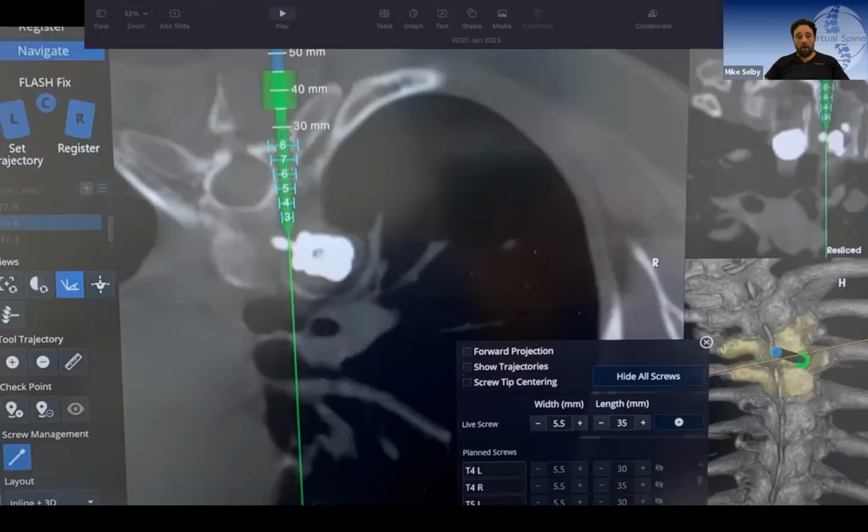We just took a pic because I was redoing a broken tether in the thoracic spine, done elsewhere, but I've got my own. And just using this technology where there are anterior screws already in the thoracic spine to plan our screws posteriorly. So this would be a super challenging case to do freehand, because with your pedicle probe, not only are you trying to get down a tight pedicle, but you're running into implants halfway down the vertebral body. So we managed to instrument all pedicles from T3 to T12 with the exception of 2, using this technology. I had a lot of sublaminar bands there as a backup just in case. Didn't need to use any of them.